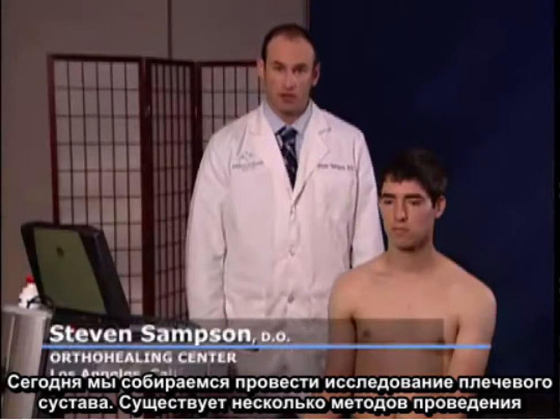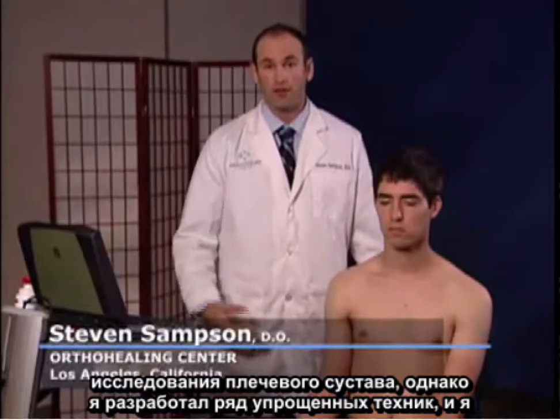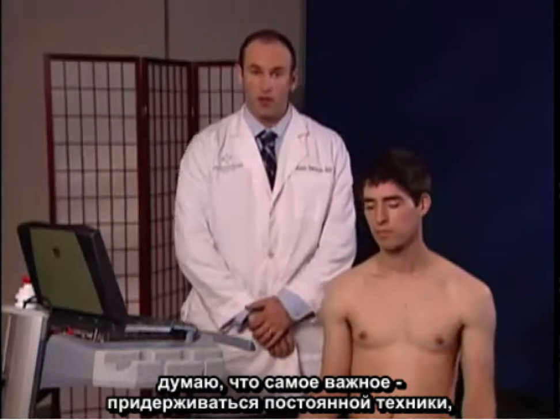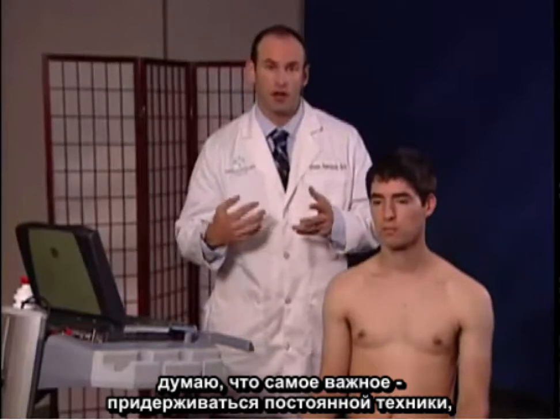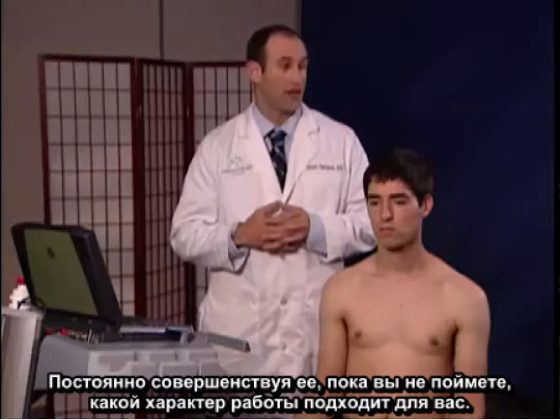Today we're going to examine the shoulder. There are multiple protocols available, however I've found some simplified techniques, and I think what's most important is to maintain a consistent protocol and repetitively go over it until you're comfortable with what exam works for you.